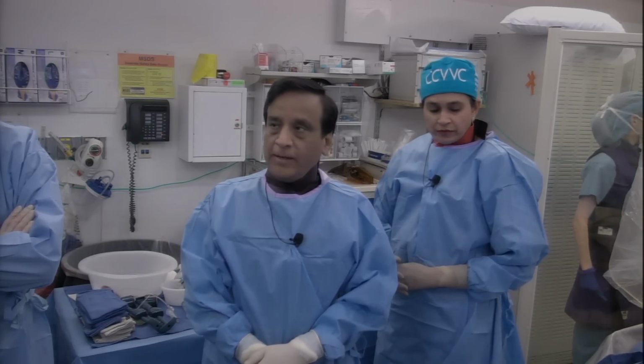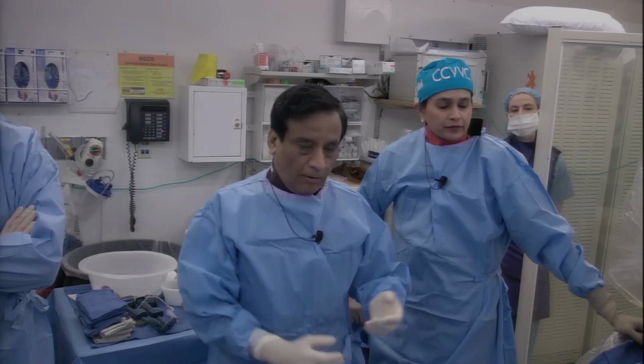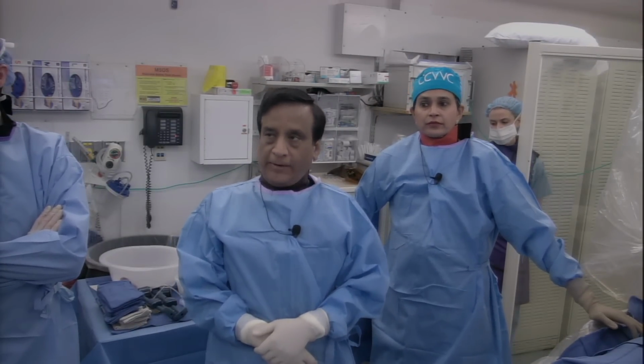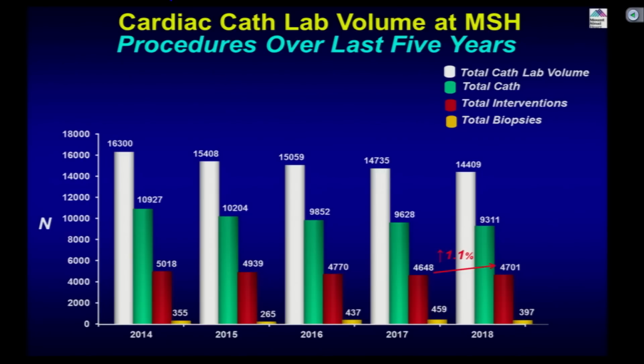Of course there is always a chance that you may have to use a bailout second stent approach, but the goal will be a one stent approach, and I'll give the reason why, compared to our routine two stent approach, which is the DK crush or mini crush. We favor mini crush because of fewer steps and yet very good outcomes and results, short and long term, in our hands. Plus the biggest challenge, an elderly gentleman.